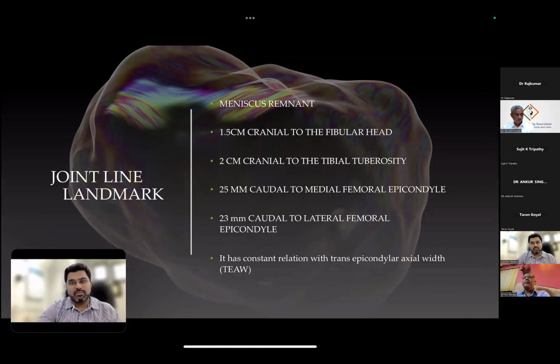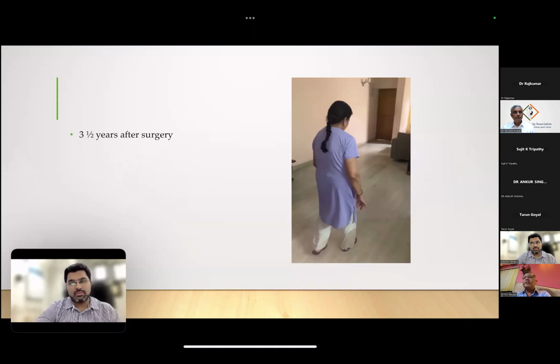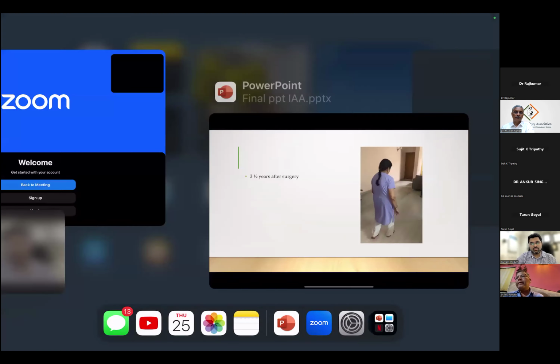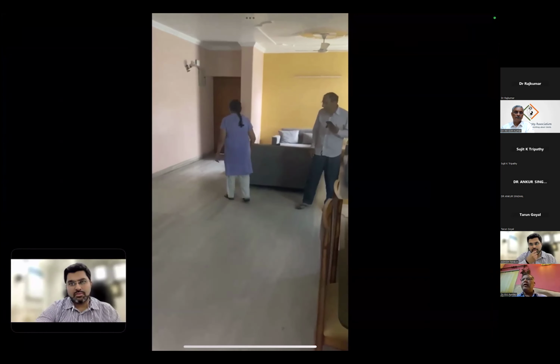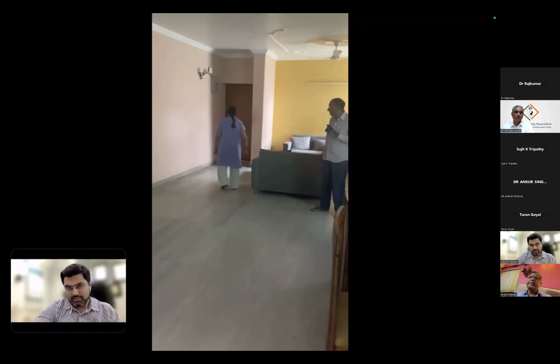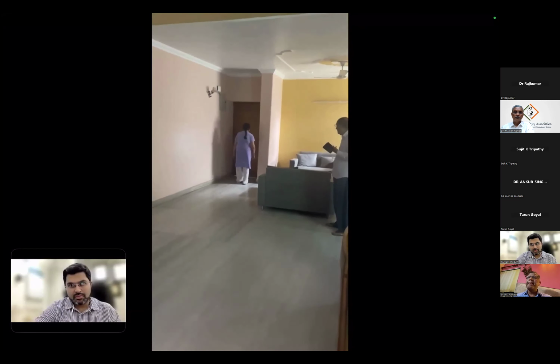So this is the joint line landmark, which has already been talked about. And just the day before yesterday, I asked the patient to send a video. This is 3.5 years after bilateral revision total knee replacement.